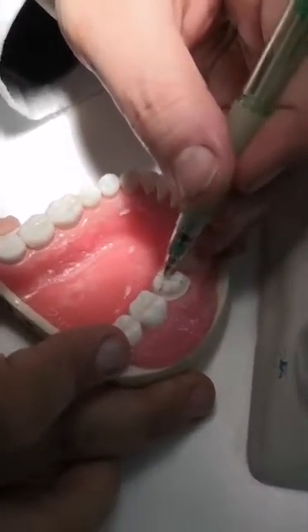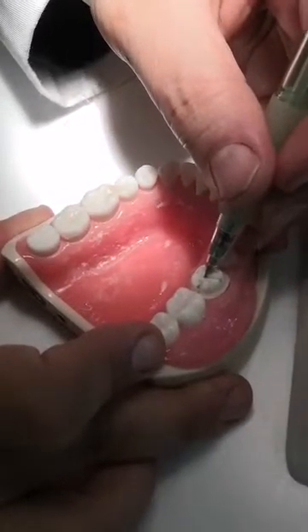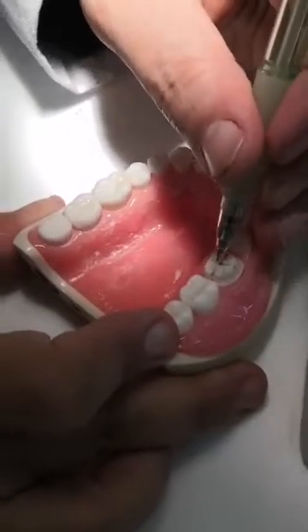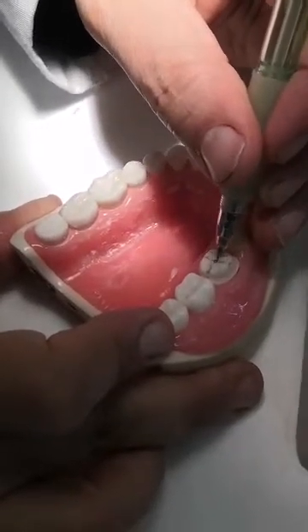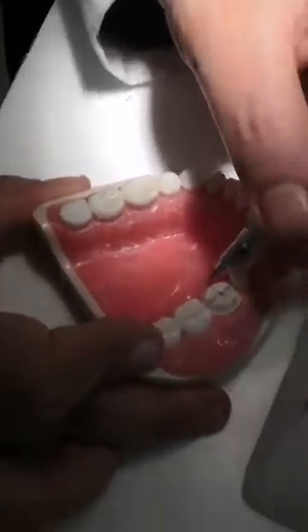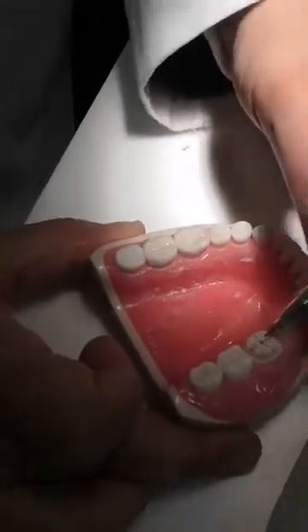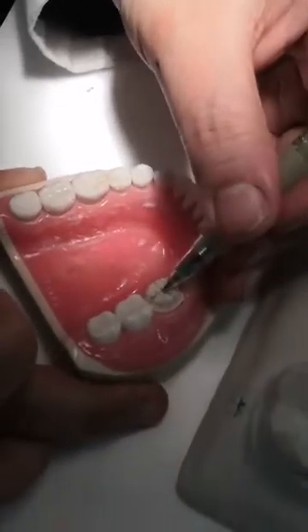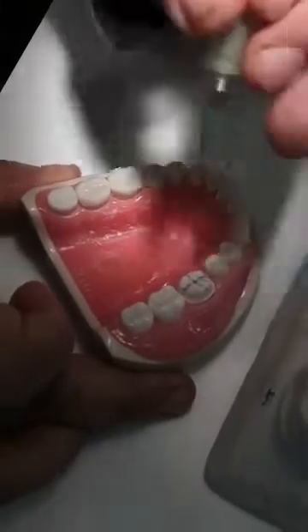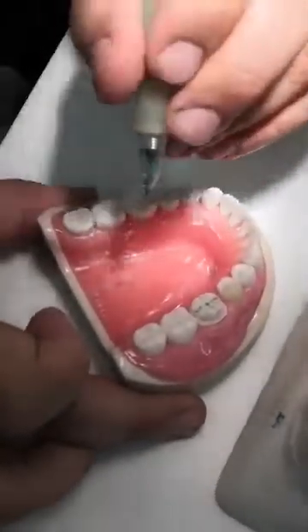The marginal ridge is open. Regarding the central area, there's like a pebble here — you have not prepared it. Just do that. But the central groove is kept in the correct location. The buccal cusp is not going towards the lingual and the lingual is not going towards the buccal. You have kept the proportions because the buccal is wider and the lingual is smaller. You have not shifted the central groove area.